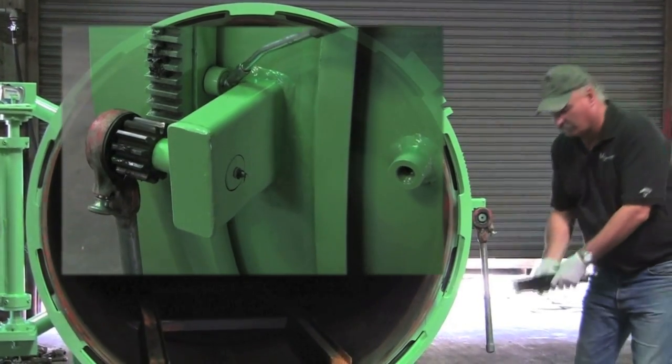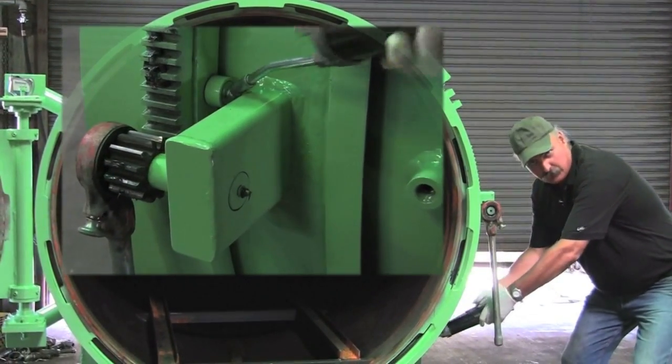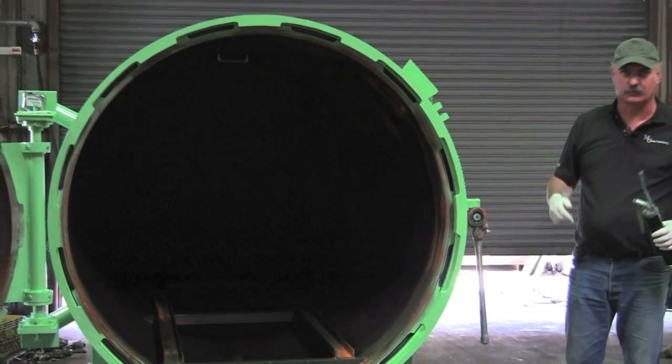On the rear of the ring are four or five cam rollers, depending on what size vessel you have. You're going to want to put your grease gun on the cam rollers and put a few shots of grease, enough to see it squirt out.